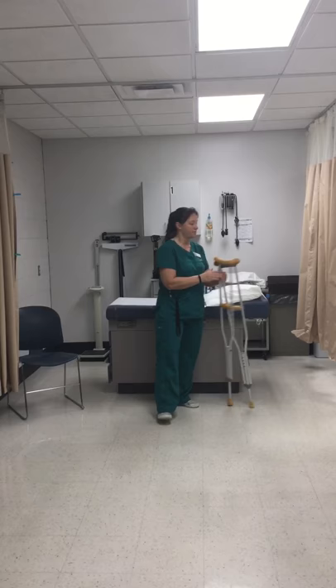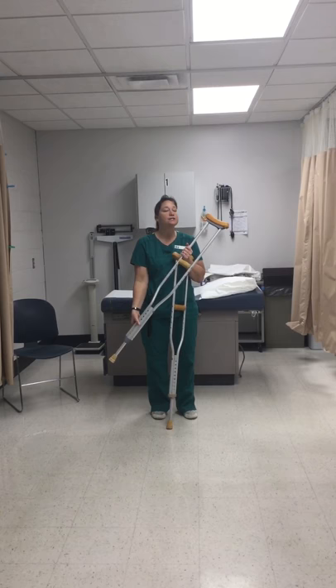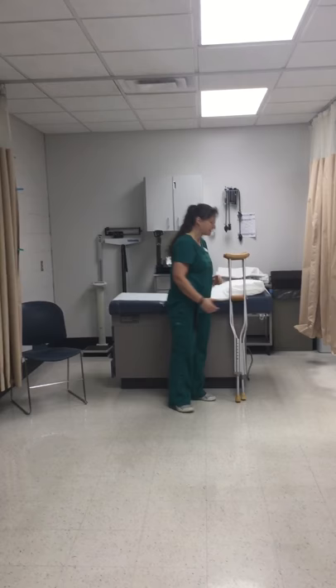The crutches are adjustable, very similarly to the quad cane and the walker. There is a push button so you can adjust it for the patient's approximate height. We'll talk about how to fit the patient for crutches specifically in just a moment.